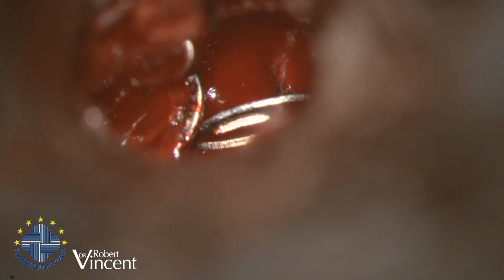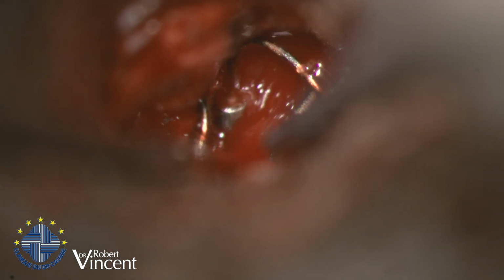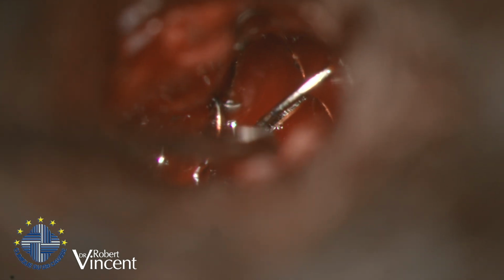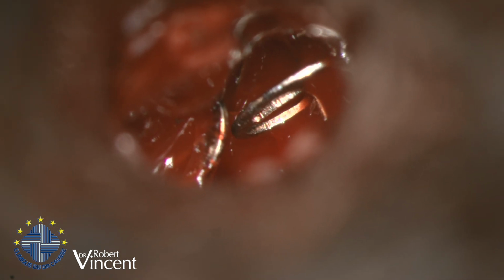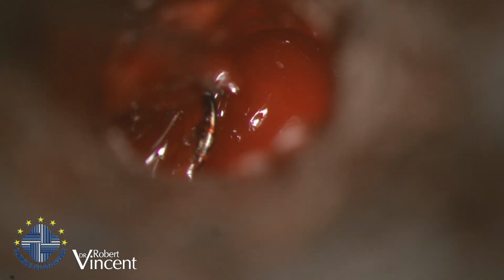Okay, I think it's fine because I think the shaft is not connected at all to the footplate. Yeah, I can remove that. Very strange. And this pick is for the cartilage plate, I guess. So I remove the first one, and I will then remove the second one.